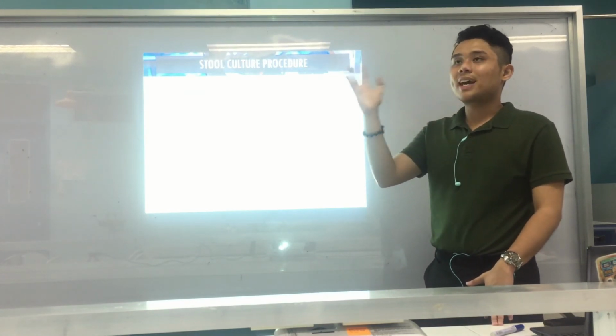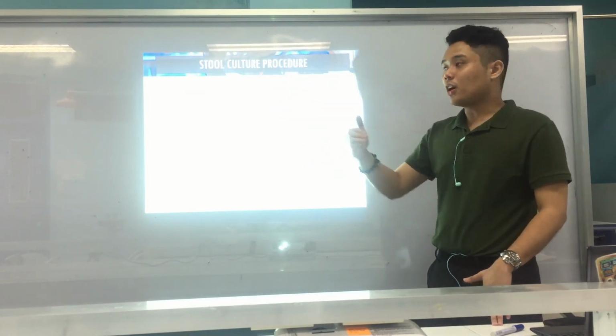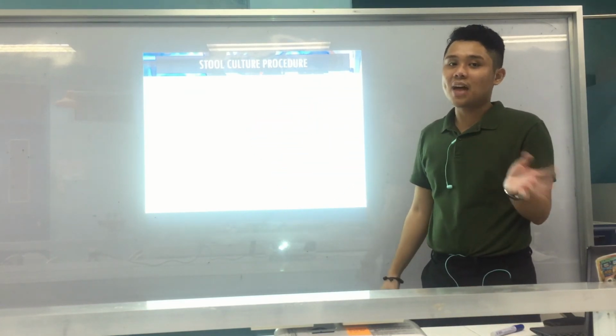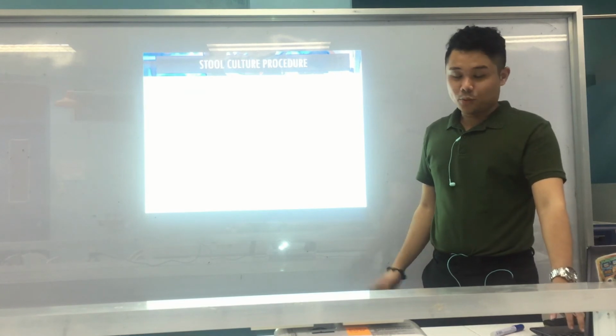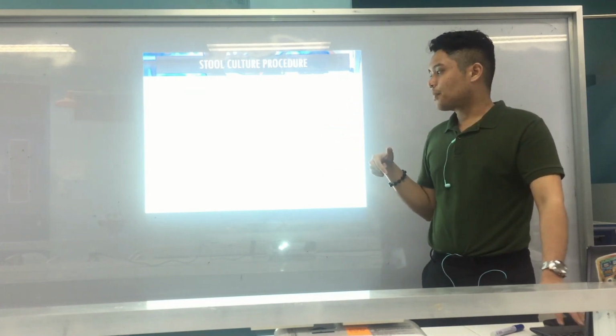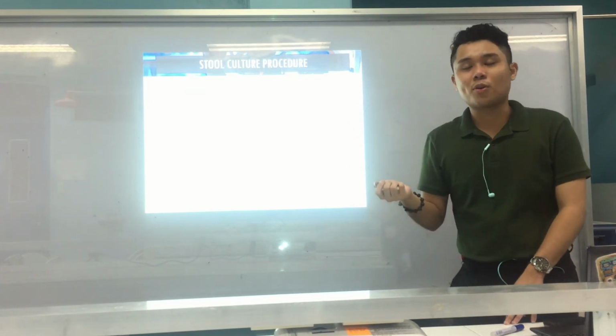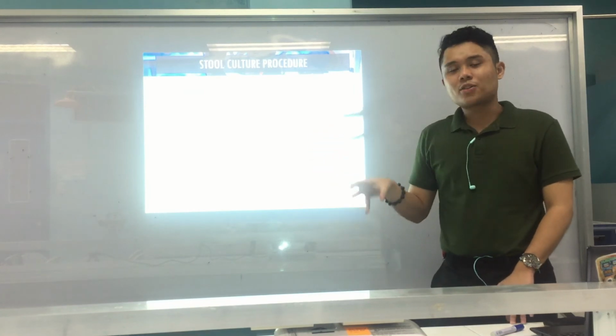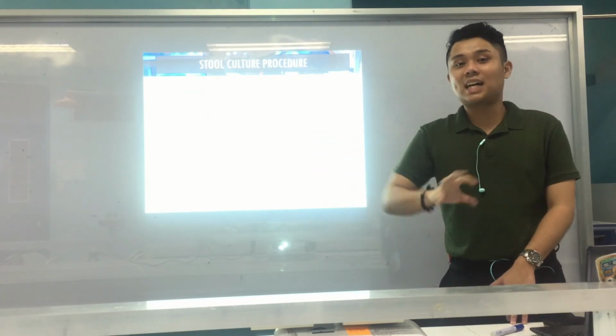And enrichment broth may also be used if there are only a few pathogens present. So you could use APW for Vibrio, or for enterics you can use selenite F, or for Salmonella, tetrathionate. Okay, we'll discuss that later. Examine plates at 24 and 48 hours and isolate single colonies with distinct morphology. So distinct colonies, especially lactose fermenters, distinctly colored colonies, or non-lactose fermenters.